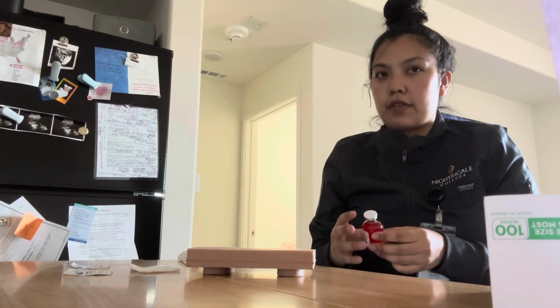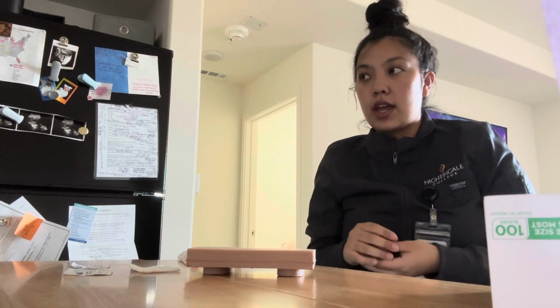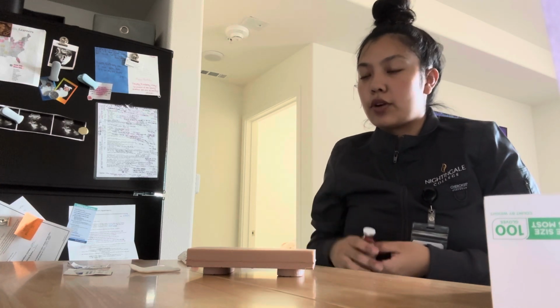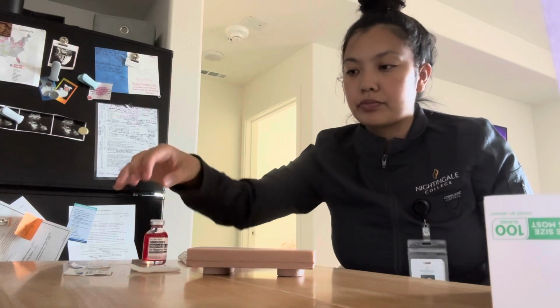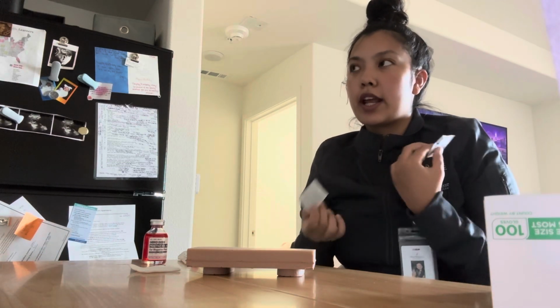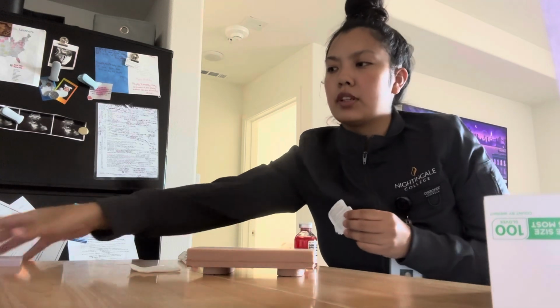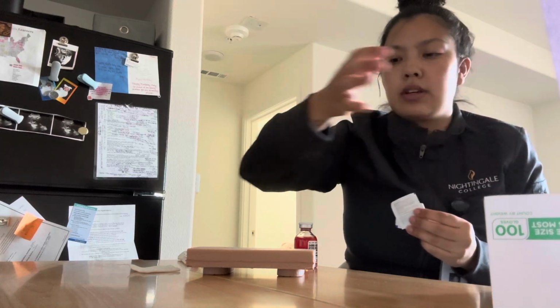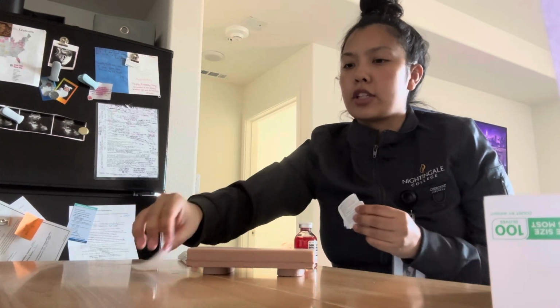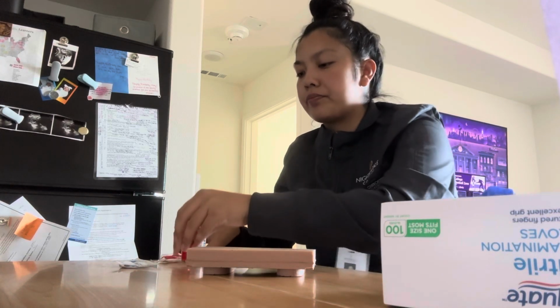I'm going to make sure that I have the correct medication, that's one from the electronic medical health record, EMR. I'm going to make sure that I have 2 alcohol prep pads, one for the skin and then one for the lid of the medication. I also have a cotton swab and some gloves. So I'm gonna make sure I have everything.